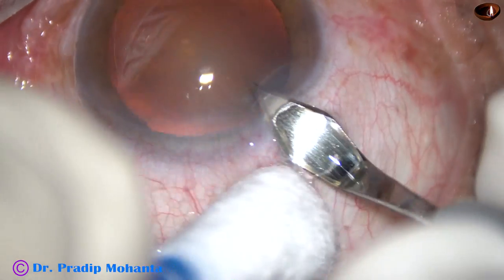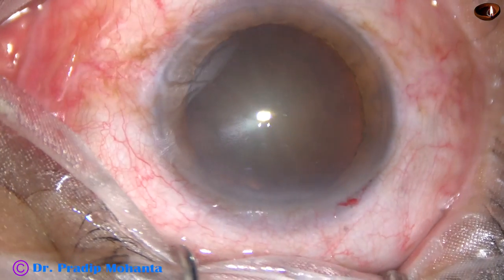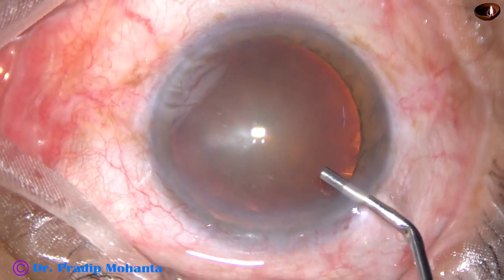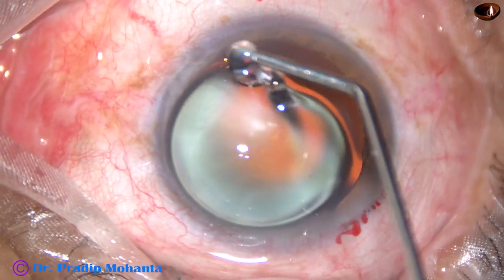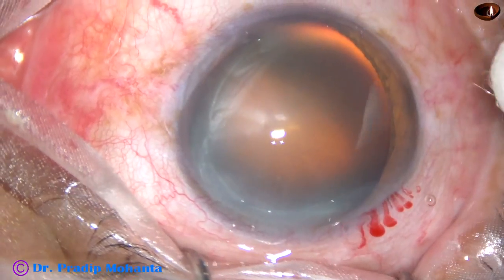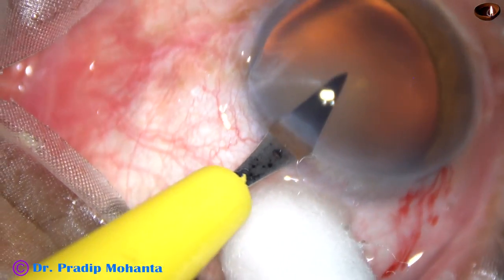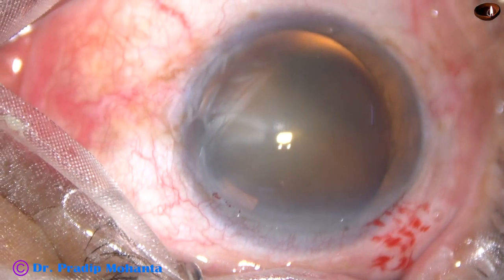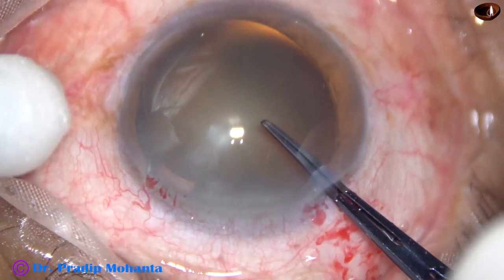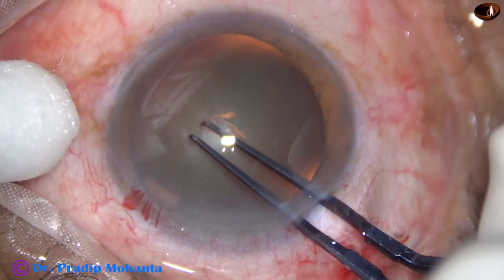This is the main incision with a 2.8 mm steel keratome on the posterior aspect of the limbus at around 135 degrees. Viscoelastic substance has been injected into the anterior chamber and applied over the corneal epithelium — this improves visibility. This is a side port on the left side of the main incision about 3 o'clock hours away, and now this is capsulorrhexis with the help of Utrata forceps.